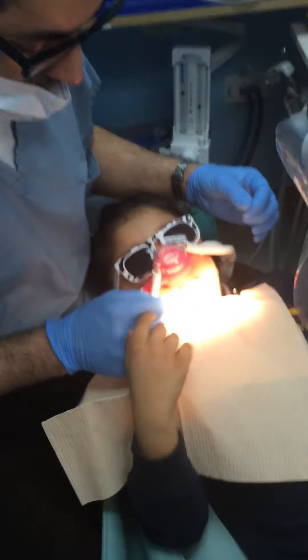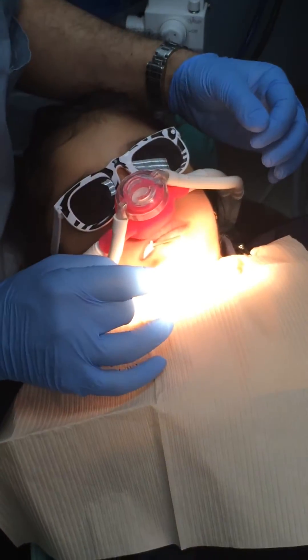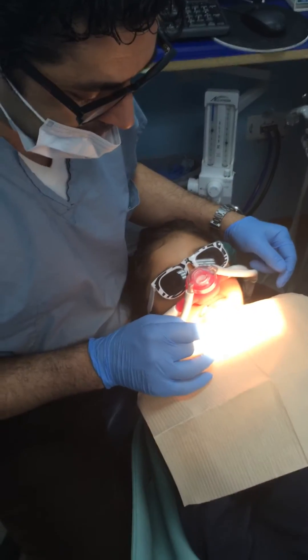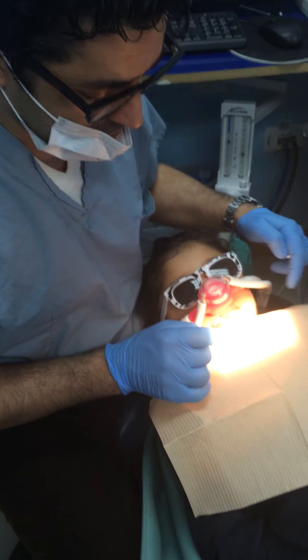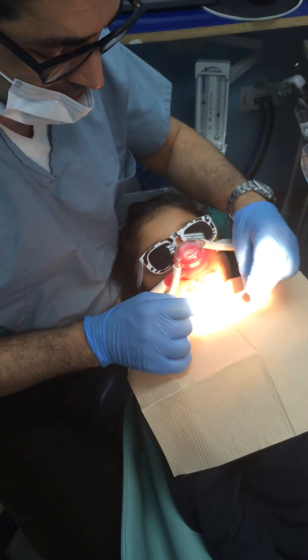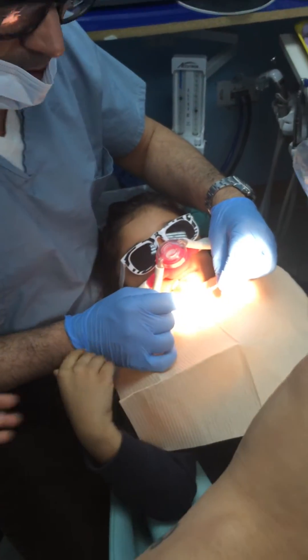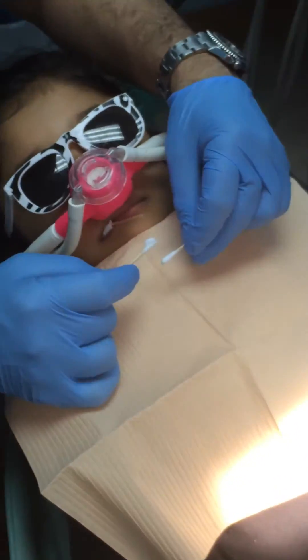We're just showing the amount of topical, which is the EMLA — 2.5% lidocaine, 2.5% prilocaine cream that we use. Use about the same size as the tip of a Q-tip. That's the Q-tip without it, and that's the Q-tip actually with it. You can zoom in and see that.